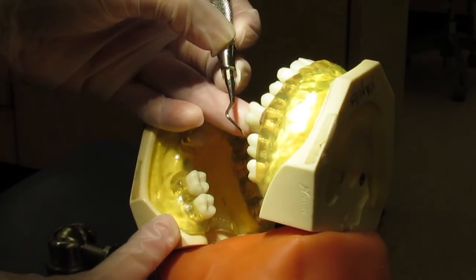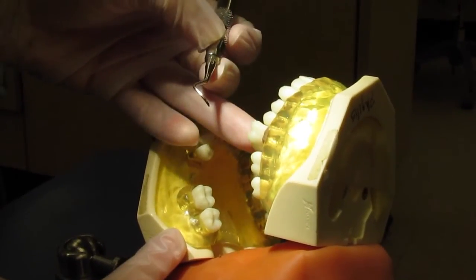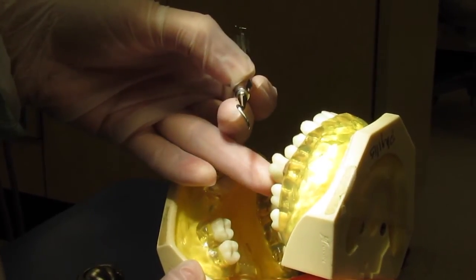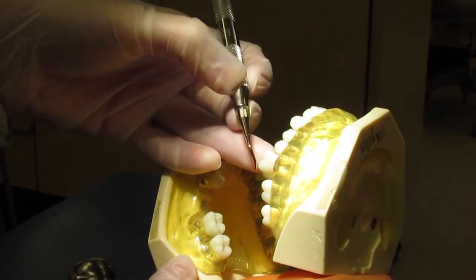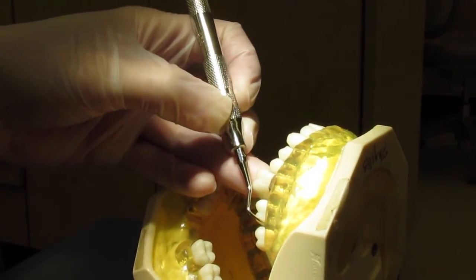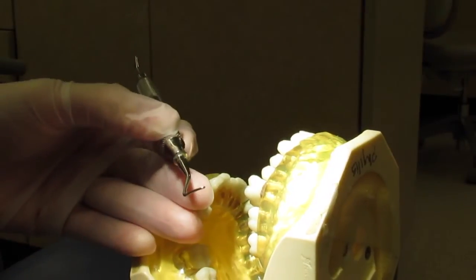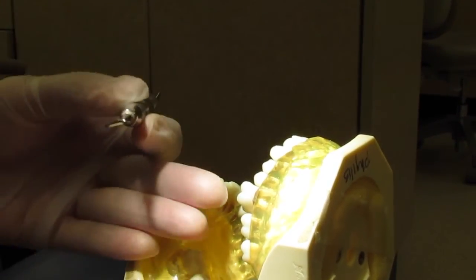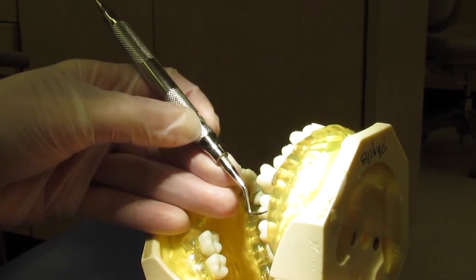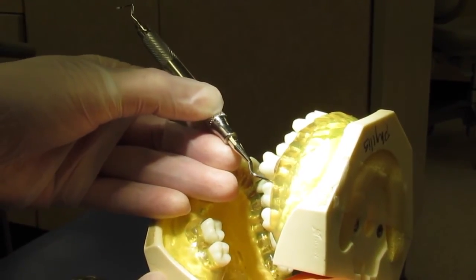This is the UC on the buccal of number 15. When using a UC to go distally, you always need to have an intraoral fulcrum — we'll fulcrum on the lingual cusp of any of the posterior teeth in front of the tooth you're working on. Place the secondary blade against the distal line angle, then rock and go distally, stopping about halfway, then come out. Going mesially, you are allowed to use an extraoral fulcrum, resting the back of your hand on the angle of the mandible. Start at the distal line angle again with a short pulling motion, then approaching the mesial line angle, roll and pivot to go mesially.